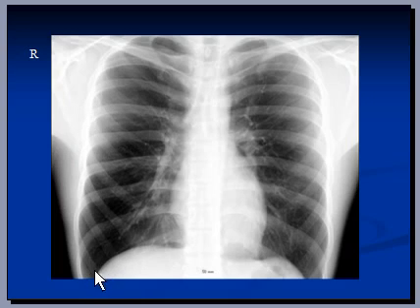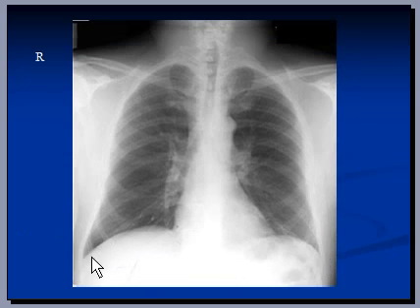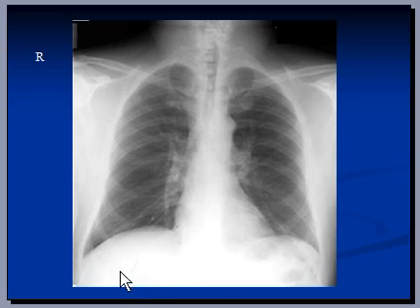The costophrenic angles are not visible on this X-ray, so it's probably not a good X-ray to comment on pleural effusion. On this other X-ray, you can see the right costophrenic angle and left costophrenic angle very nicely and clearly. If there was a small pleural effusion, this is the area that will go blunt and you won't be able to see either the right or left costophrenic angle, depending upon which lung the pleural effusion is in.